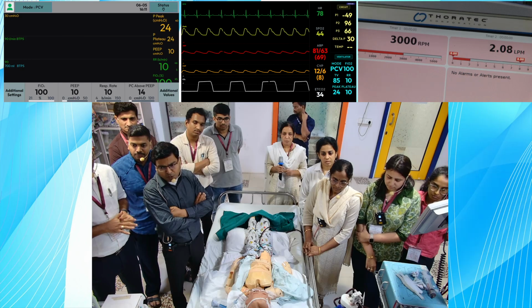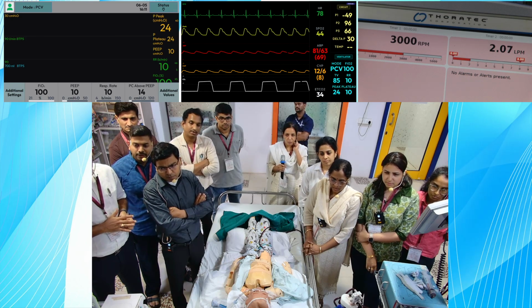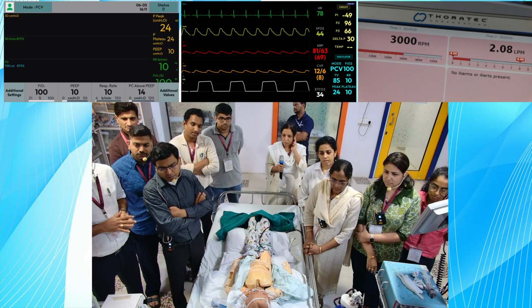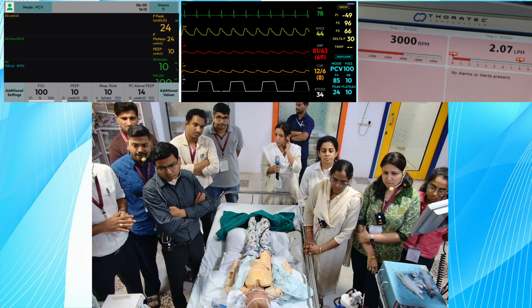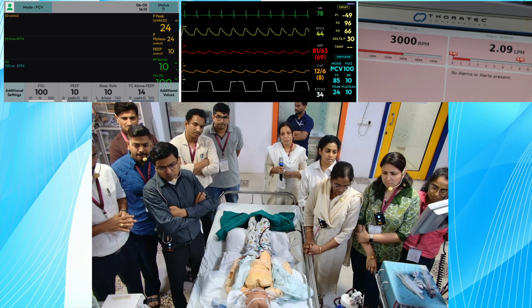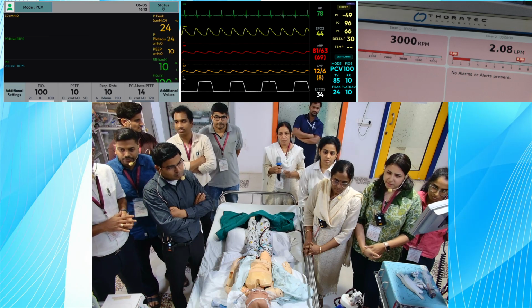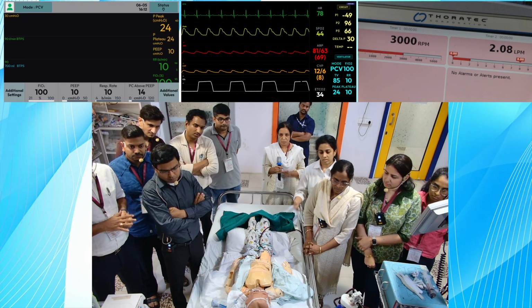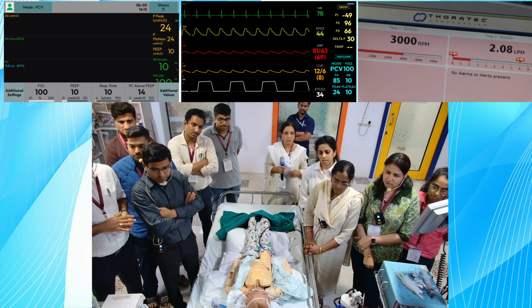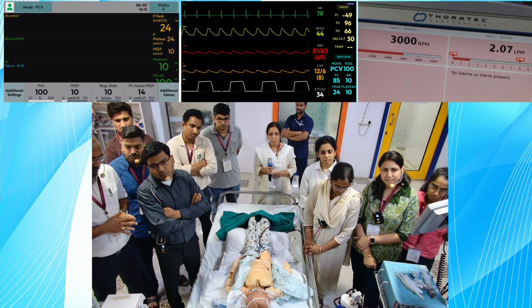Membrane edema was ruled out. We have flushed it with 15 liters. Membrane edema is also not there. In membrane edema again desaturation will not occur, isn't it? So what else? The cannula position is the same as it was before. There is no recirculation component happening. Are you suspecting recirculation here? No, it is a dark color. Dark colored, so recirculation is also out. Then what?